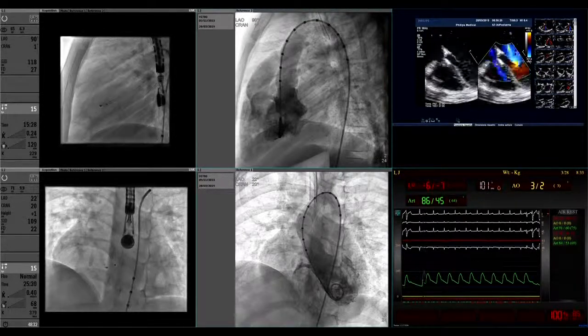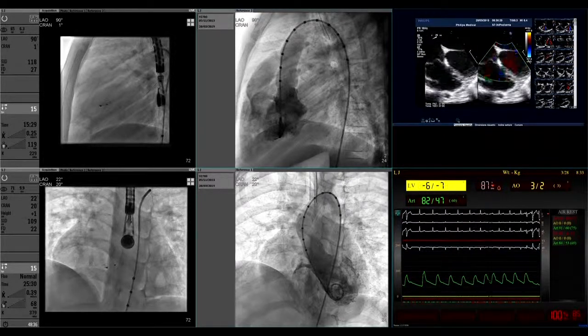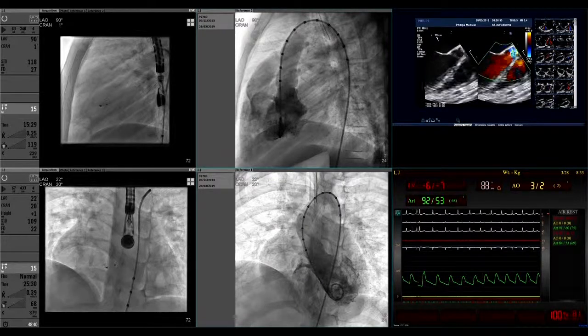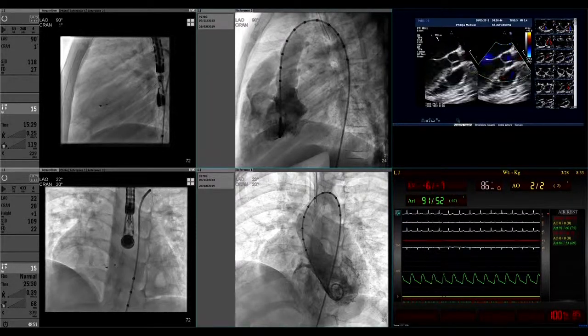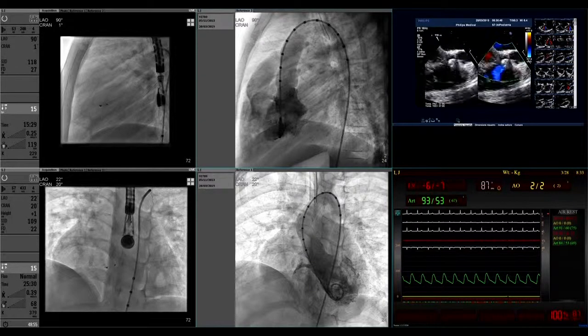So, I think there is no need to repeat an aortogram, Tin, yes? Yeah, the aortic valve looks perfect on echo. Can you see echo now? We don't need to repeat an aortogram because the aortic valve is working perfectly. There's zero aortic regurgitation, no residual shunts. So I think that's a perfect result. Very good, guys. Mario. Yes?